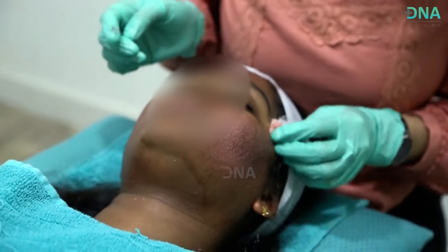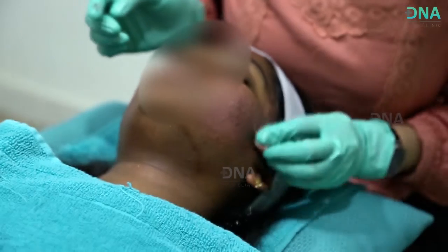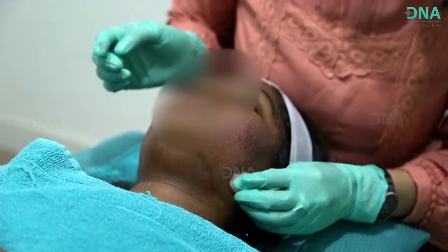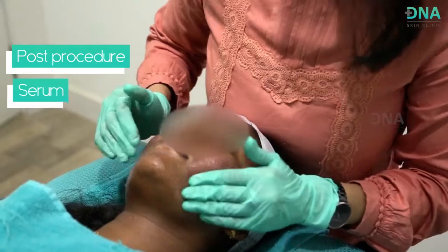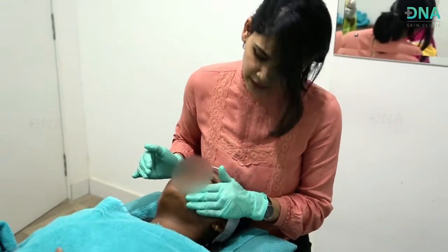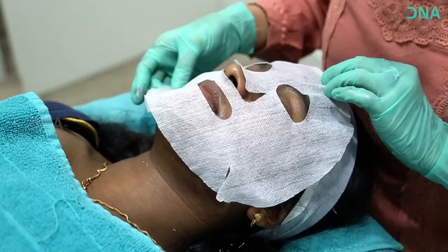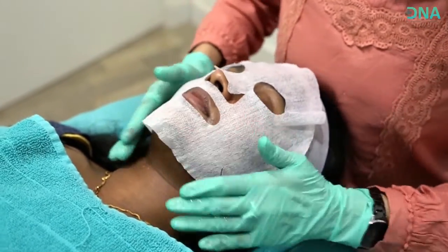Make sure that all the materials that you use in the procedure are well sterilized so that there is no chance of any form of infection happening post-procedure. Post-procedure, I'll be applying a serum onto the treated area. This helps in cooling the skin a little bit, soothing the skin a little bit, and also helps in better wound healing. Then we cover the treated area with a mask, and we leave it on for about 5 to 10 minutes.